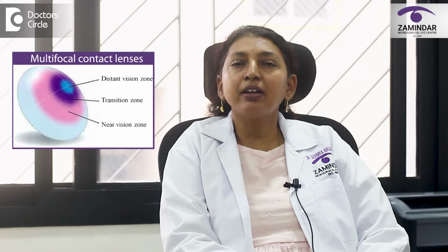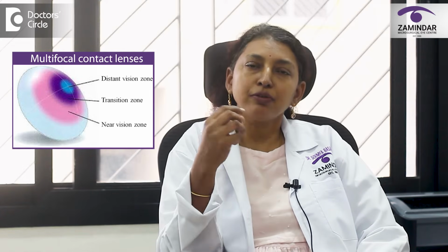We have the other category called the multifocal lenses, where there are two focal lengths where we can use it for distance, intermediate and near vision. Like your progressive glasses, we have multifocal contact lenses also.